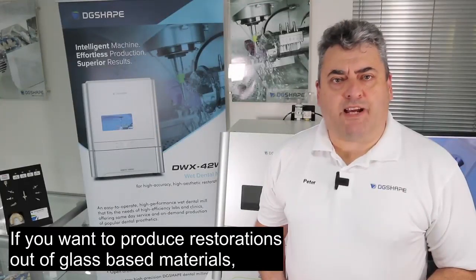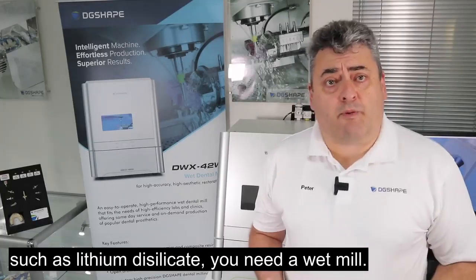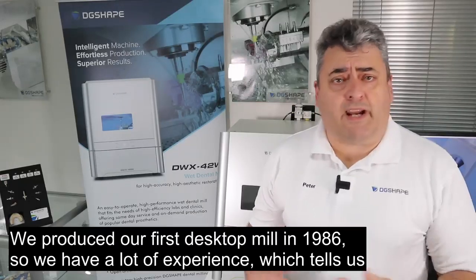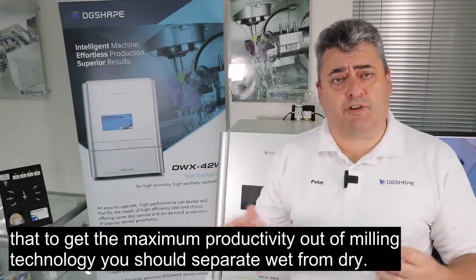If you want to produce restorations out of glass-based materials, such as lithium disilicate, then you need a wet mill. We're one of the pioneers of desktop milling and we produced our first system back in 1986. All that experience tells us that to get the maximum productivity out of milling technology, you should separate wet from dry.